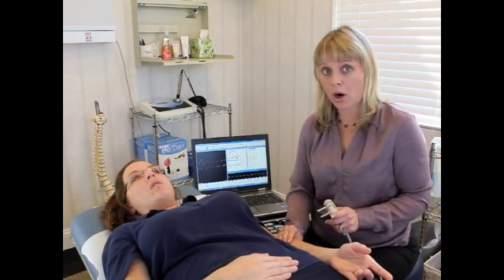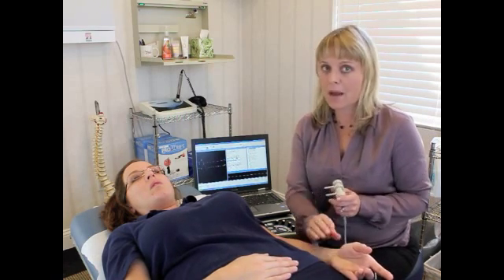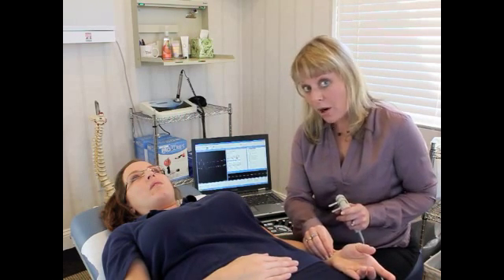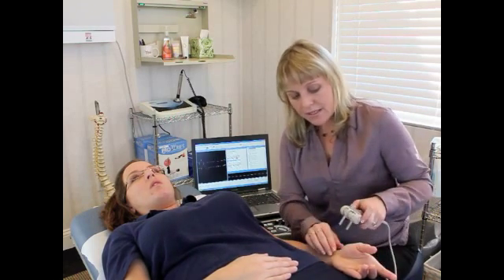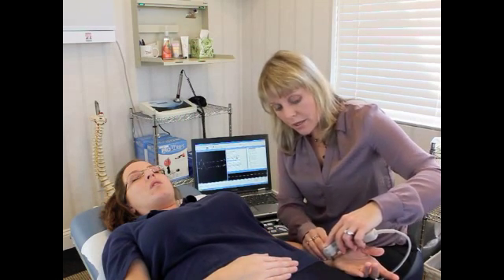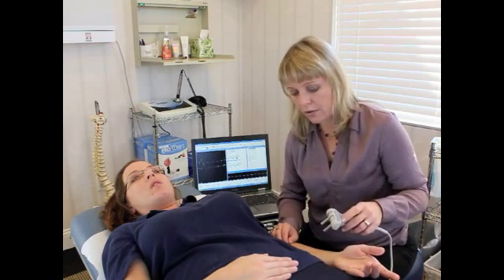Let's say we're looking at the arm, and maybe we're thinking you might have something like carpal tunnel symptoms. Many people know about carpal tunnel. So when we're talking about carpal tunnel, you have that pain in your hand. Sometimes you wake up at night with that pain. We're going to do this test. First, we start at the wrist. And we just use a little bit of an impulse here to see how that nerve is firing. We want to know how fast that nerve is firing.